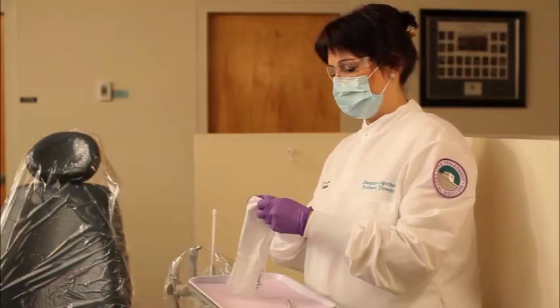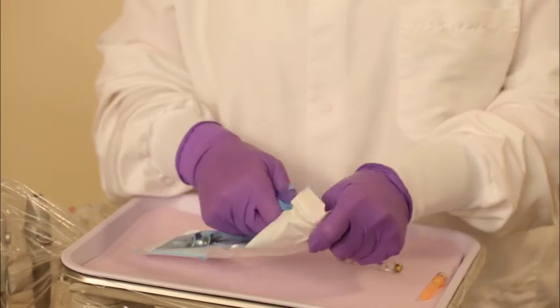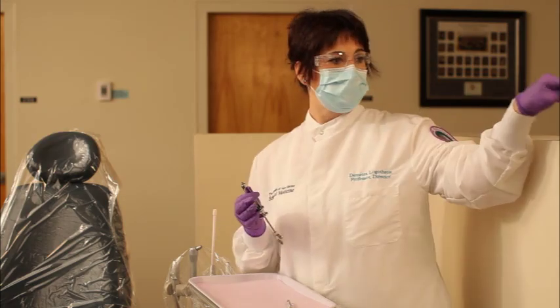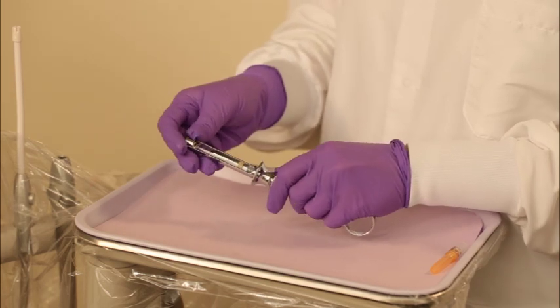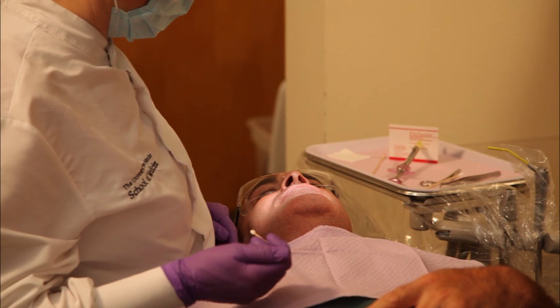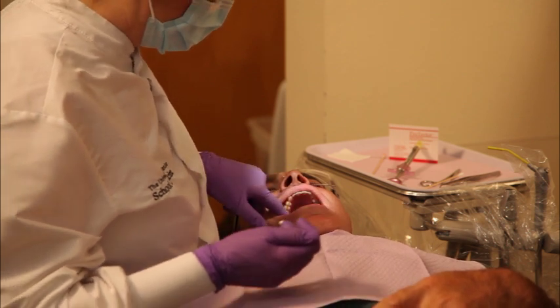Load the local anesthetic syringe as demonstrated in the procedure, loading the metallic or plastic cartridge type syringe. Before injection, follow all steps as demonstrated in the procedure, basic injection technique. Assume the correct operator positioning at 8 o'clock for a right-handed clinician or 4 o'clock for a left-handed clinician. Ask the supine patient to open his mouth comfortably wide.